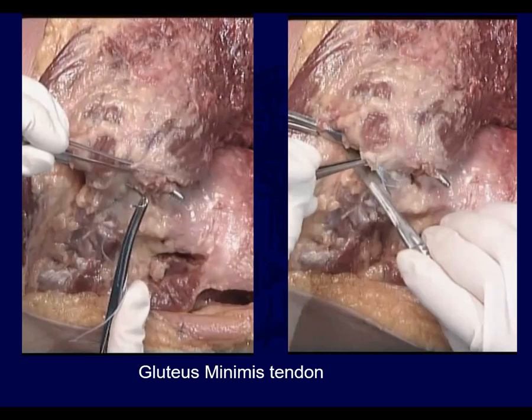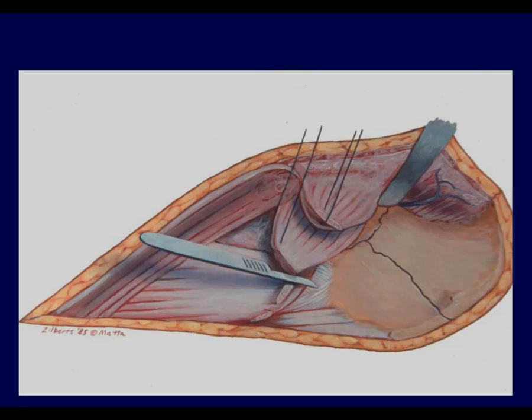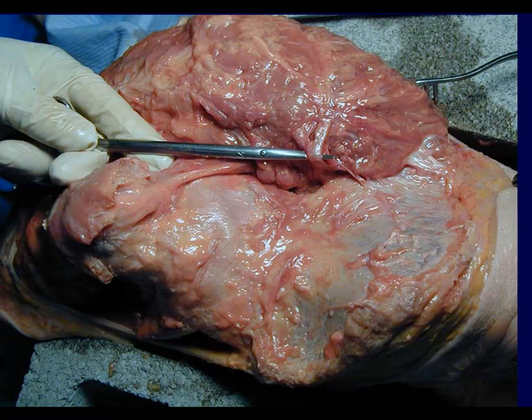Basically you've taken the tendons off. Here you can see the tenotomy of the abductors off of the femur — everything's already taken off of the pelvis. You have a retractor in the sciatic notch, and everything's being reflected posteriorly. This is a cadaver, so the tissues are not ideal, but the ilium and hip joint will be here.